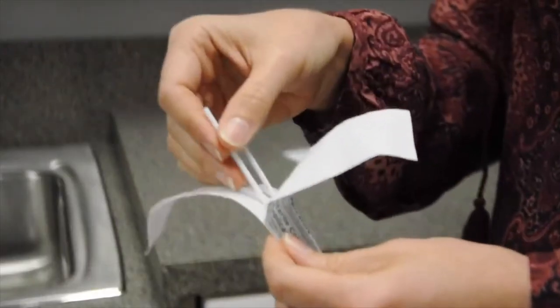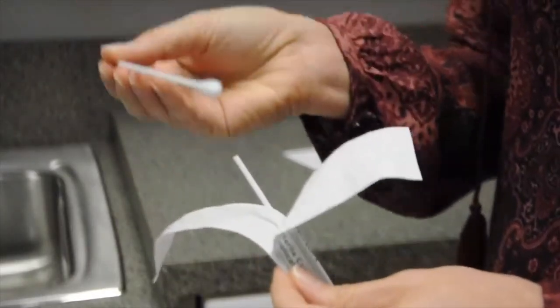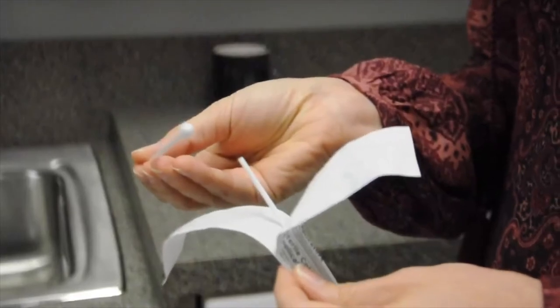Remove only one of the swab applicators. Avoid contact with the cotton tip. Open your mouth widely and insert the applicator. For at least 30 seconds, aggressively scrape the inside of your cheek using a back and forth and up and down motion. Rotate the swab applicator several times. Avoid excessive saliva.